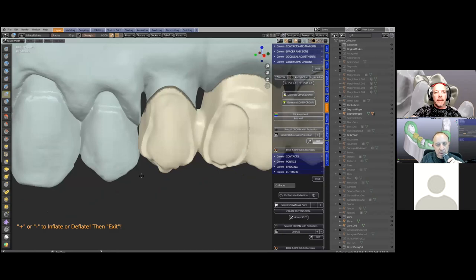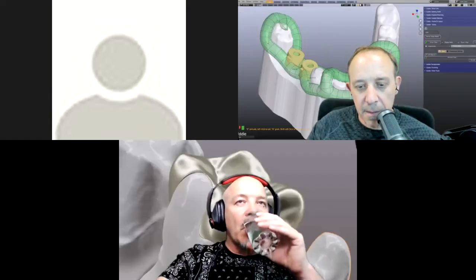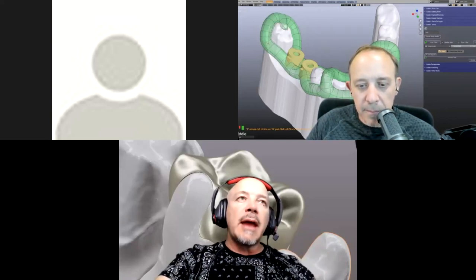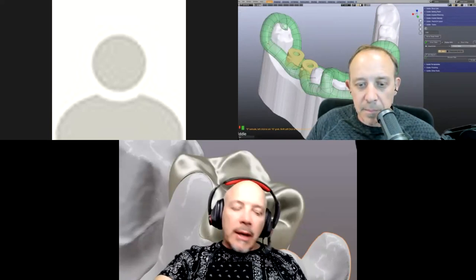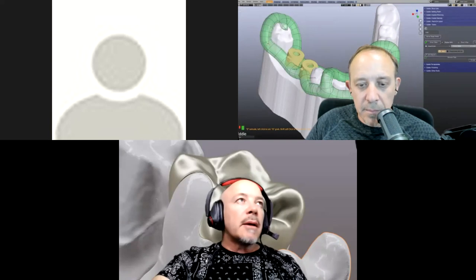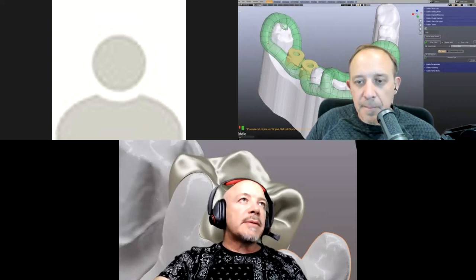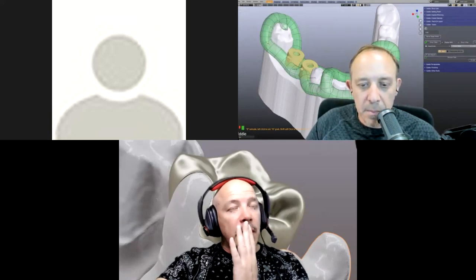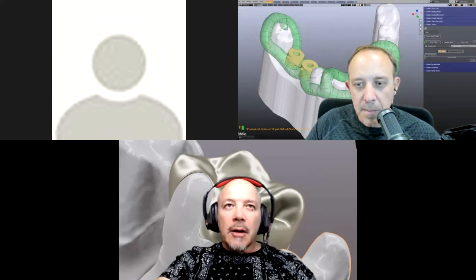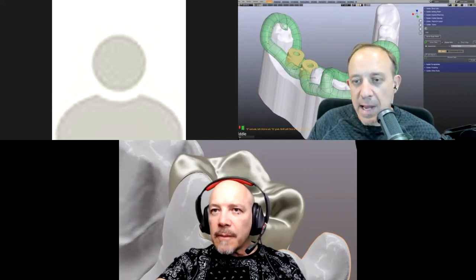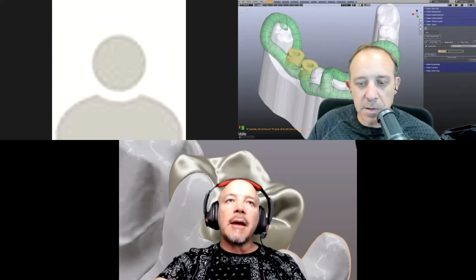Question from the chat: on the central that we did, is it possible to do just the incisal cutback? Yes it is. But of course we can opt not to make a coping — we can opt to use the tooth like a crown and then do the cutback just on the crown. Yes, we would then be using the actual tooth and making a smaller version of it — so you subtract from the full tooth.